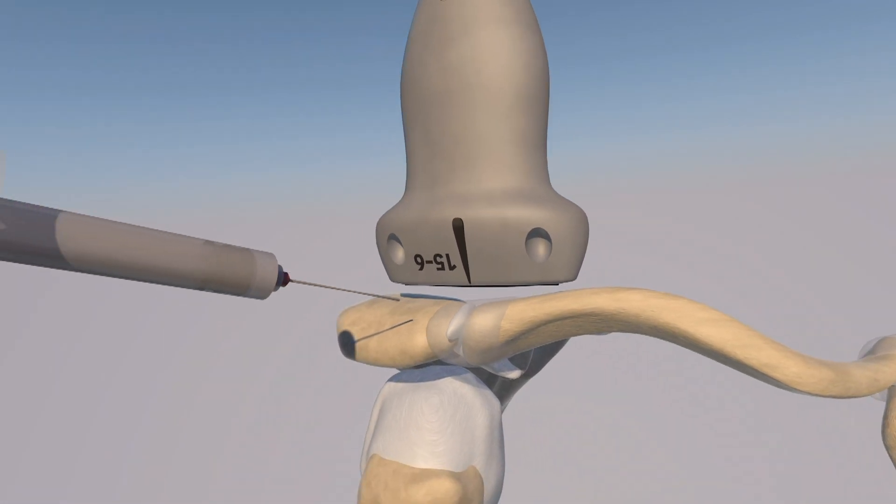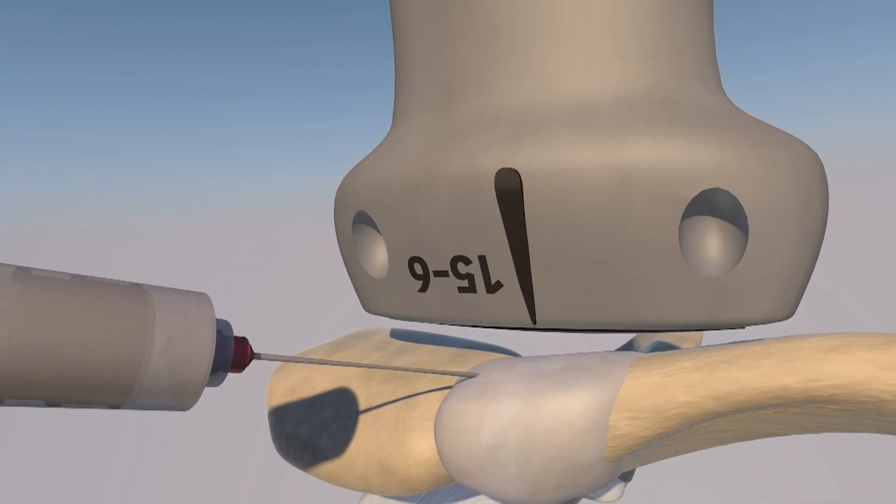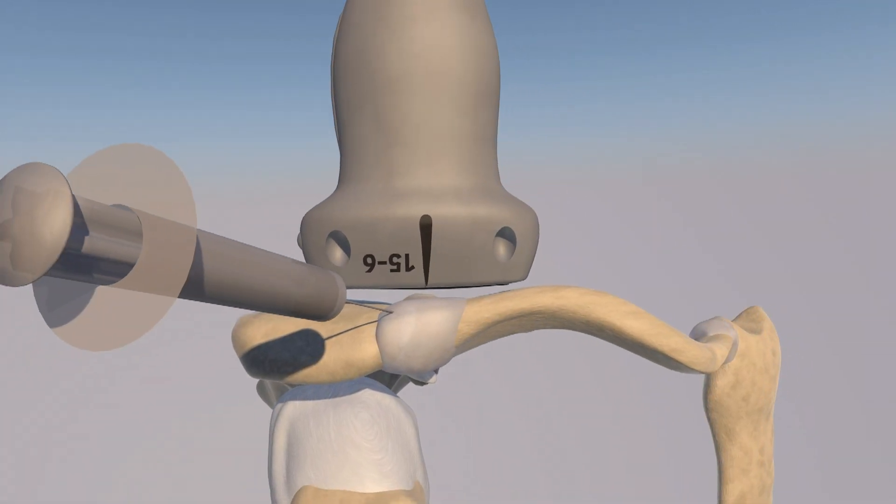Here is our initial approach, which is an out-of-plane approach, where essentially you just see the tip of the needle getting just under the capsule of the acromioclavicular articulation. Here we are injecting that joint, and you can see some distention of the capsule as you inject.